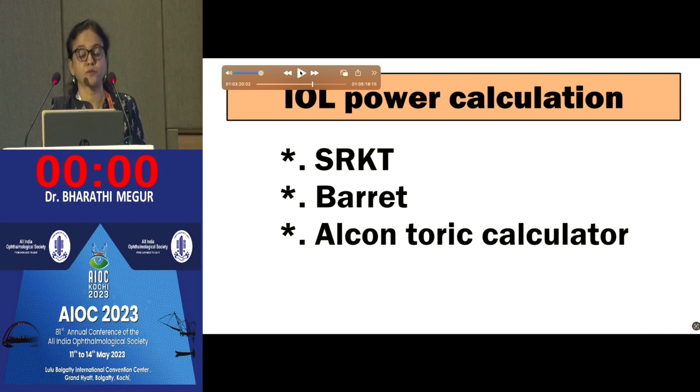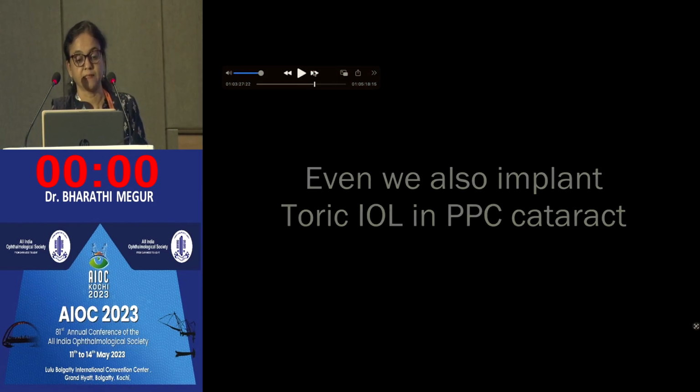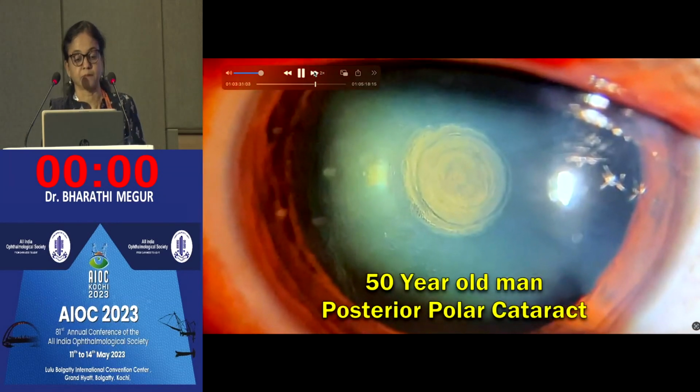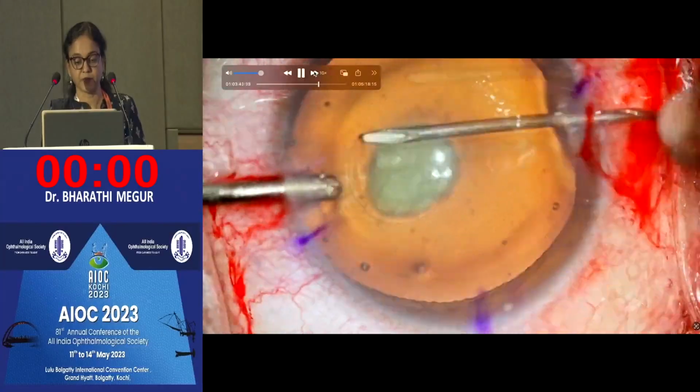Suppose you would want to choose an Indian IOL, the Indian manufacturers themselves have their own online calculating devices through which they would provide you the sheet for implanting the IOL, including the axis to be implanted. So we have Acreol and Biotech, I think. These are the companies where we do get IOLs from Indian companies. Let me rush through this video.